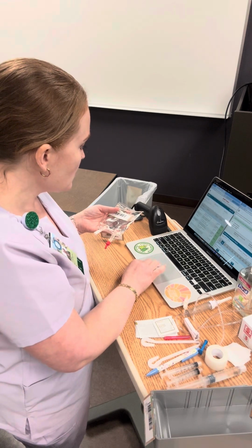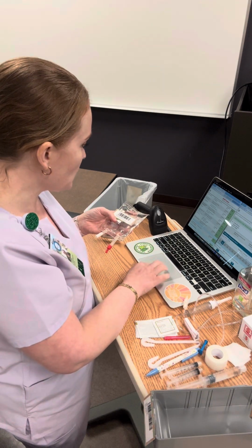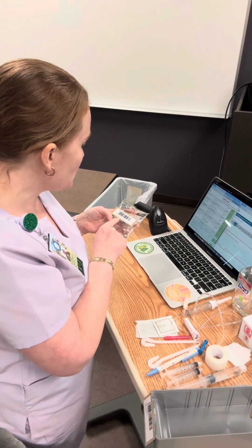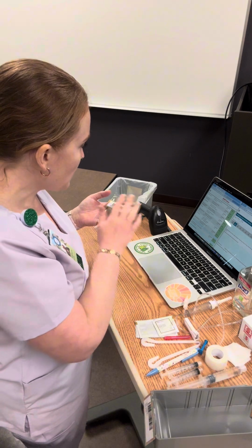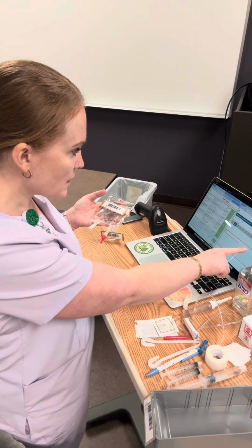On my orders, I'm going to find meropenem, and in my hand I have meropenem. Now on my MAR, I'm going to scroll down to find meropenem. My route is going to be injectable infusion, IV. In my hand, it's what I have. On my orders, IV piggyback is what I have. And on my MAR, IV piggyback is what I have.